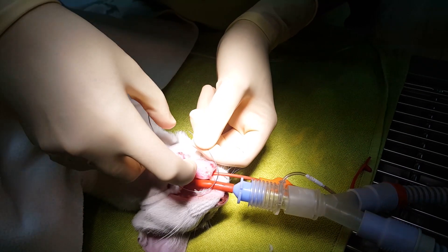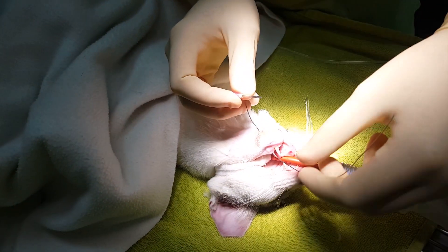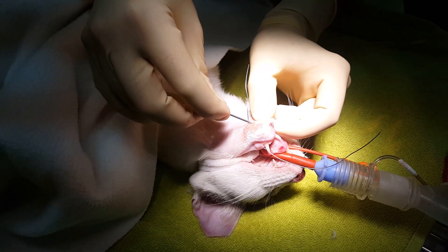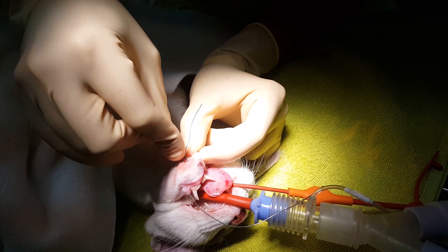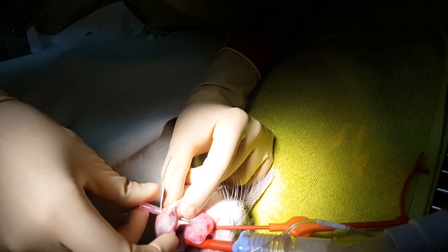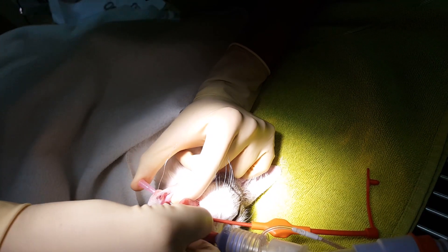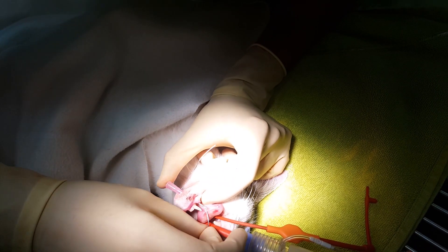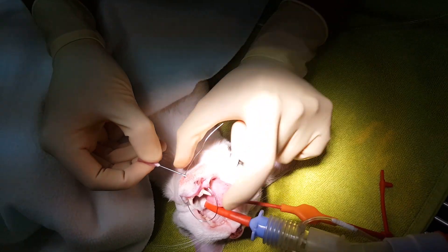We're going to do the same thing on the other side. I'm going to insert the needle again — this is a guide. We need to insert the second part of the wire, so we're going to insert the needle laterally and come out again laterally, just immediately behind the right canine, and we're going to insert the wire back through the needle until it comes out the other side of the jaw.